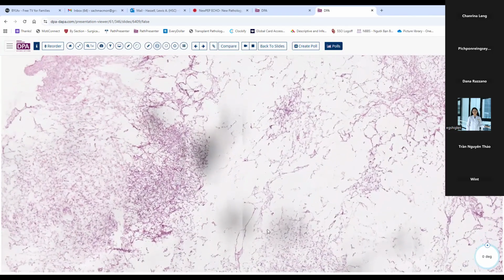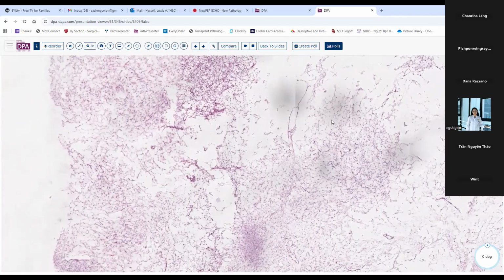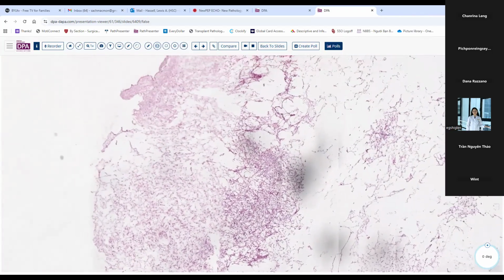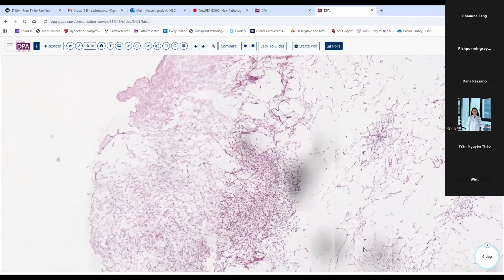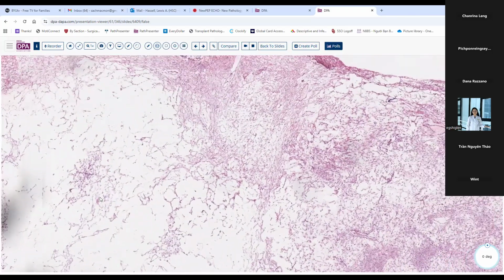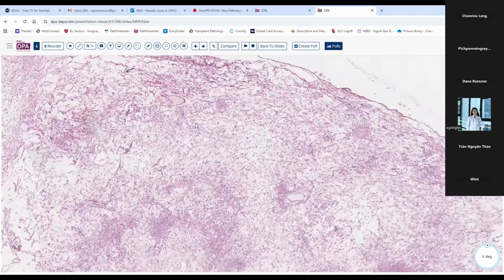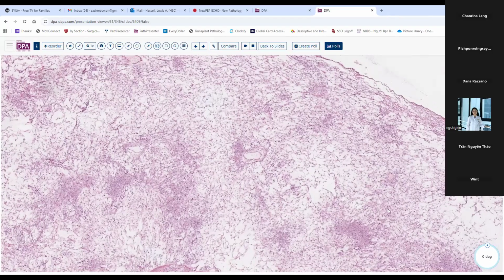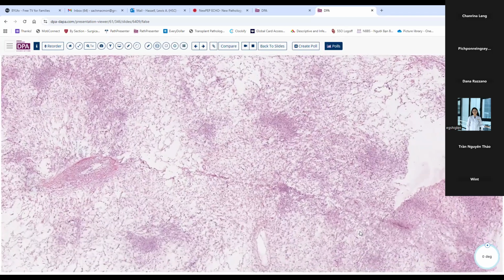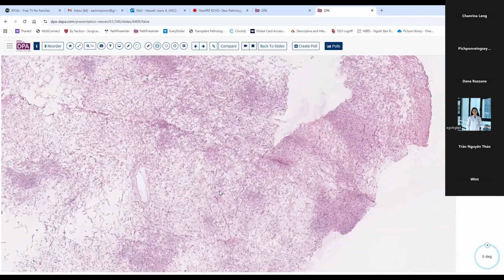Certainly there are cases where fibromas with massive edema, or even some sclerosing stromal tumors, can have very edematous areas that look somewhat like this. But where everything looked this way and we didn't see any evidence of there being anything else, we considered this as possibly more consistent with massive edema of the ovary.